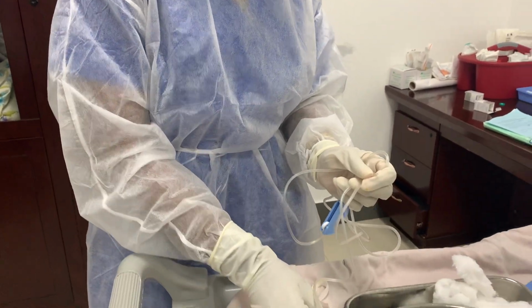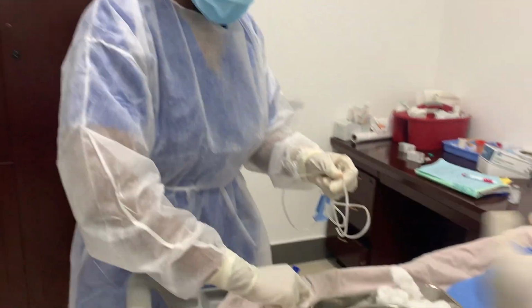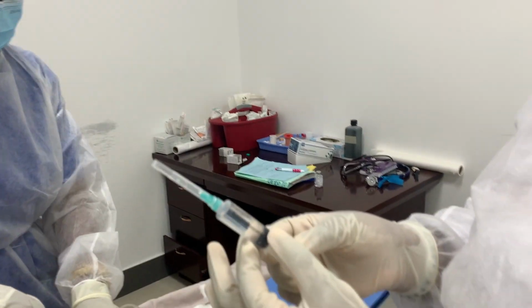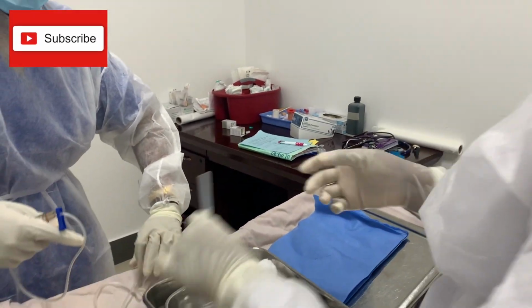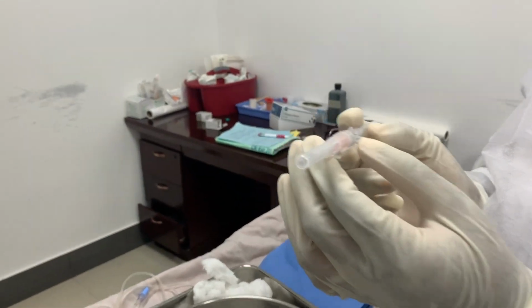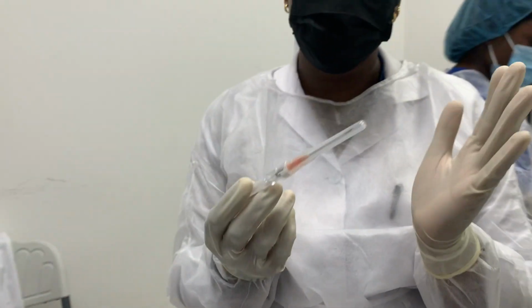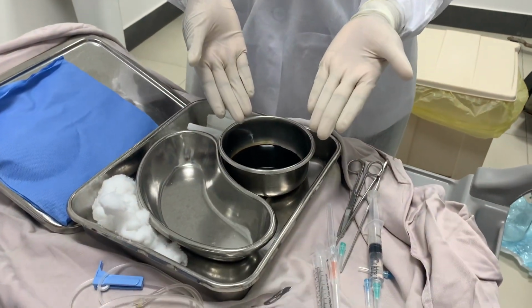Okay, so we have our lidocaine already in our syringe with the needle attached. We have our IV line that we're going to be using for the tapping procedure. We have betadine.